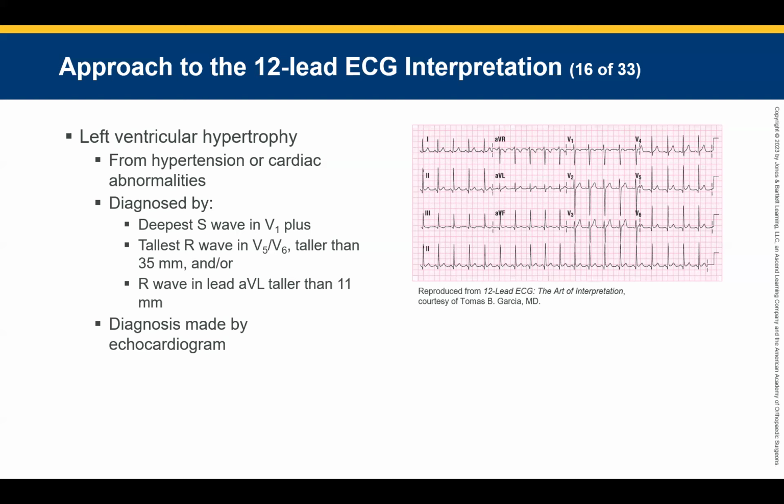So this is hypertrophy, okay? Diagnosis is made by an echocardiogram. And what we're seeing is these large R waves. They're running into each other. The cardiac output may not be great. It's what they call the ejection fraction, the amount of blood shot out with each beat, may not be great, okay? We're gonna treat the symptoms. So if they're hypotensive, we're gonna give them fluid. You know what I mean? We're not gonna freak out about this rhythm. We're just gonna treat the patient, not the monitor.